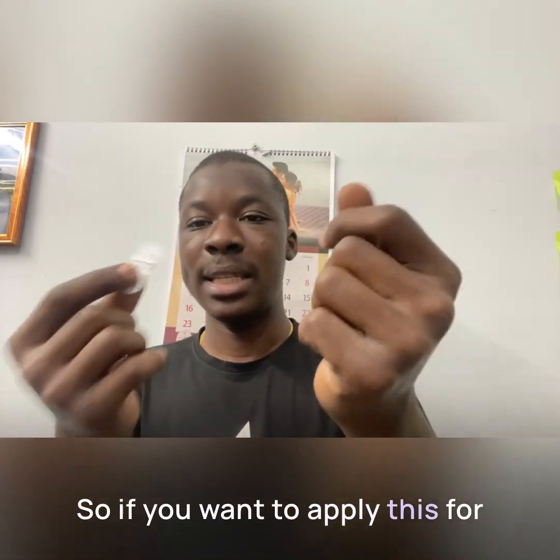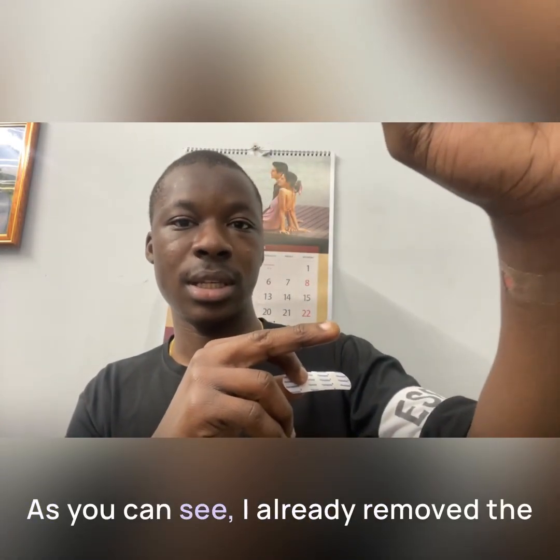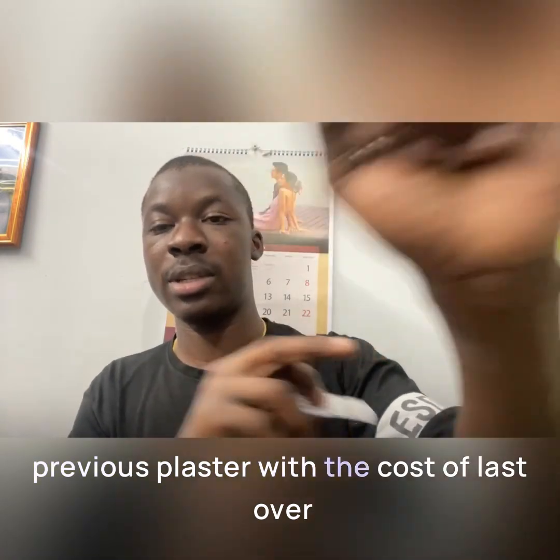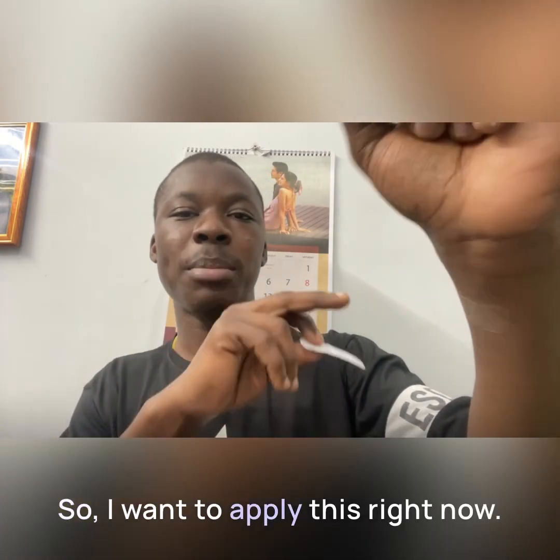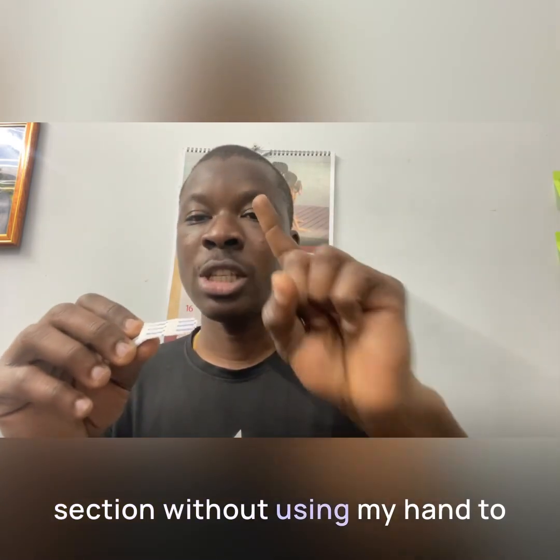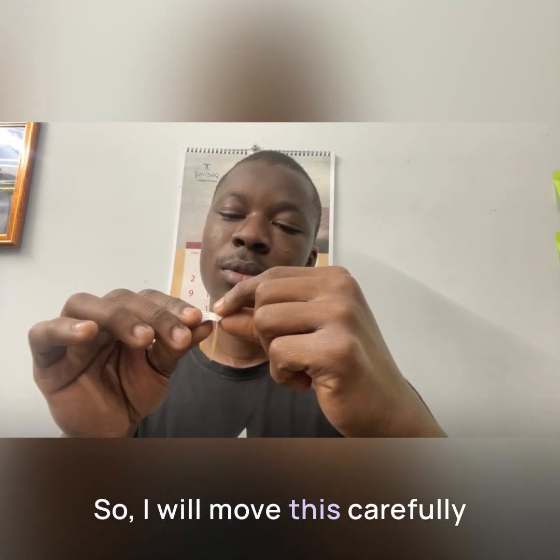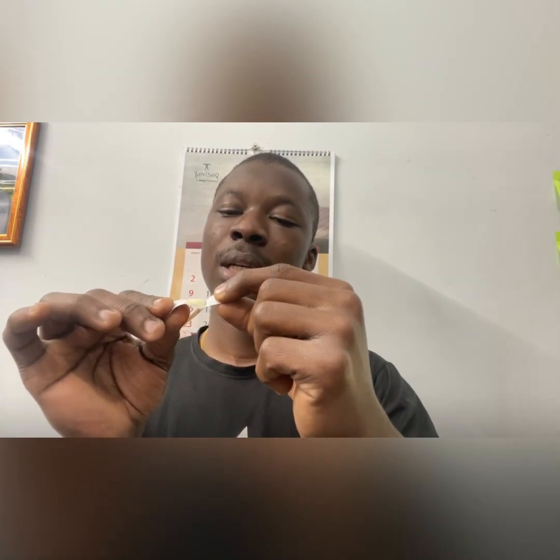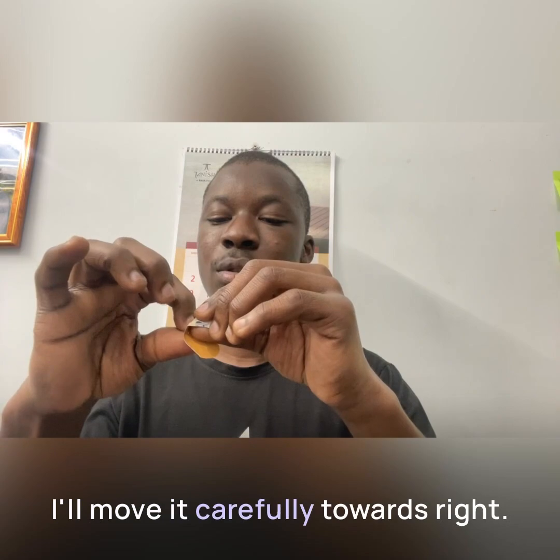If you want to apply this, for example, right now I want to apply this on my wound here on my hand. As you can see, I already removed the previous plaster because it's lasted over 24 hours and is due for changing. So the first thing I need to do is carefully open this section without using my hand to touch the surface of the plaster. I will move this carefully towards the left, and do the same thing to the second one as well. I'll move it carefully towards the right.